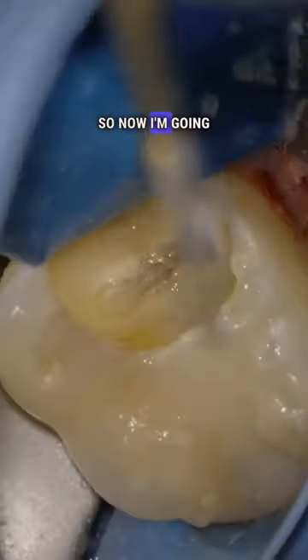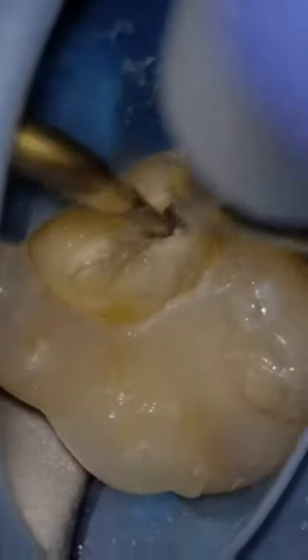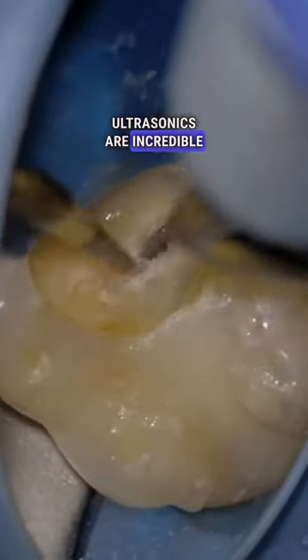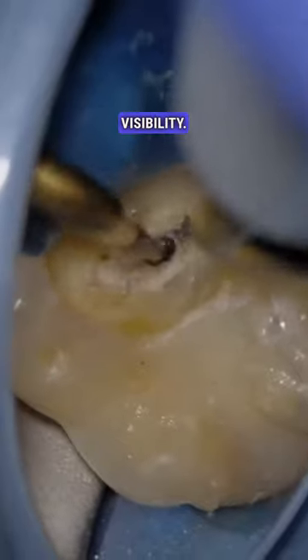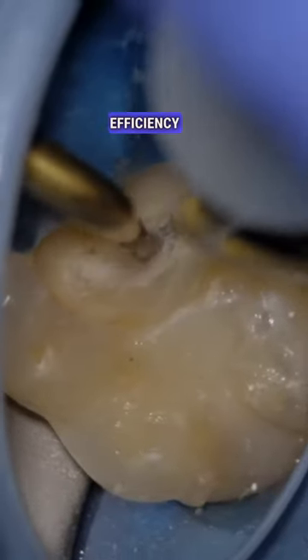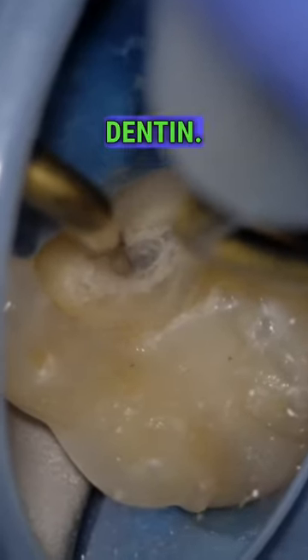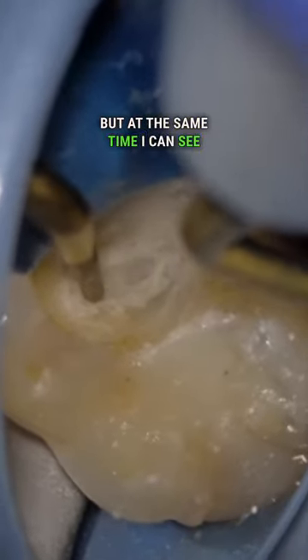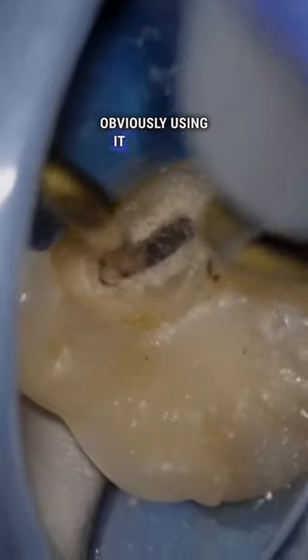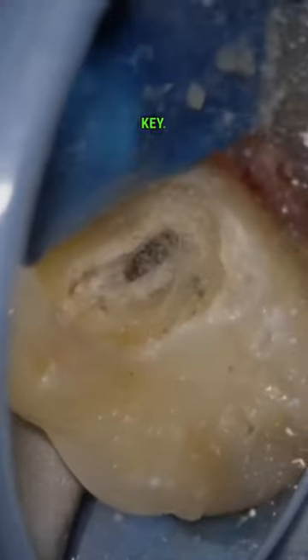So now I'm going to start to utilize ultrasonics. Ultrasonics are incredible for endodontics. Look at the visibility. Look at the efficiency at removing dentin, but at the same time I can see. Obviously using it dry is the key.